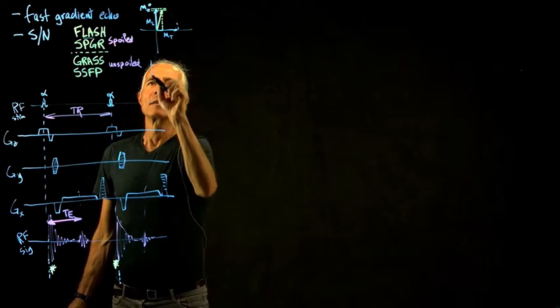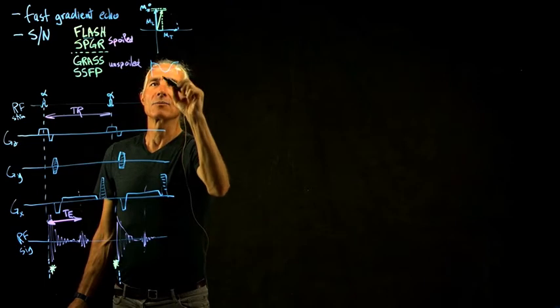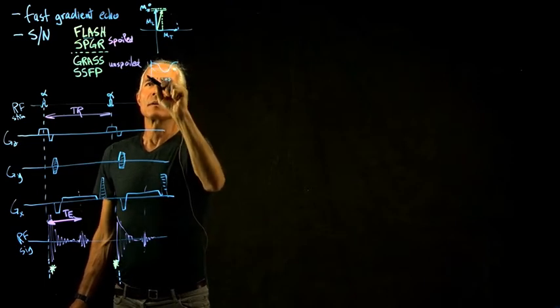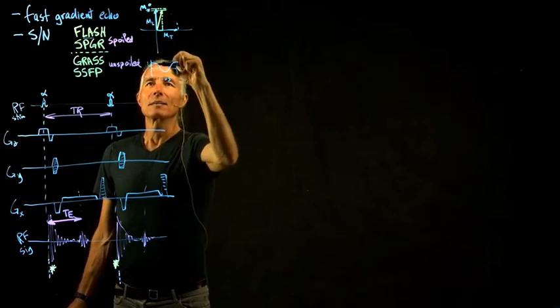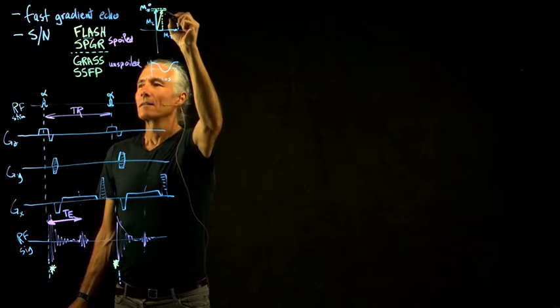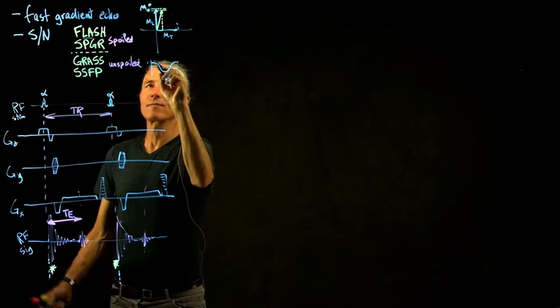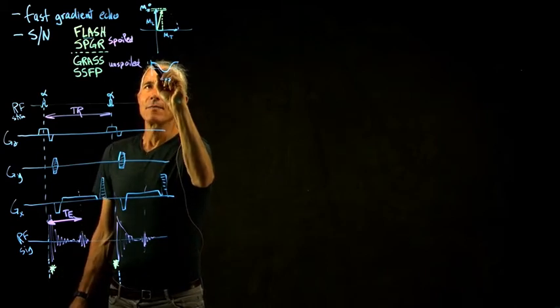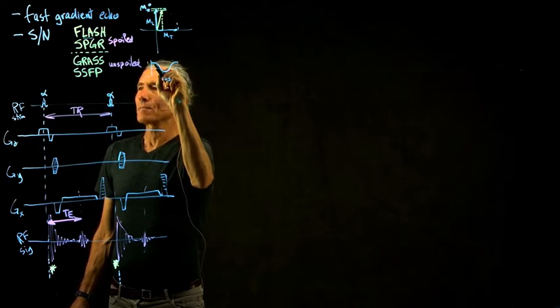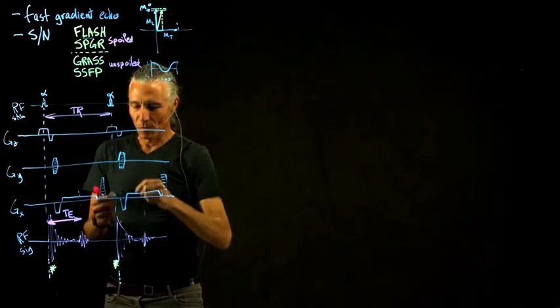So if we look at our cosine function, we have something that looks like this. So that's a cos, from 1 to minus 1. The amount that we kill, that distance, is proportional to where you are on the cosine curve. If you don't do any flip at all, you don't do anything. But if you do a small flip, you'd still hardly do any damage. Whereas this one is proportional to the sine. So what is the sine?